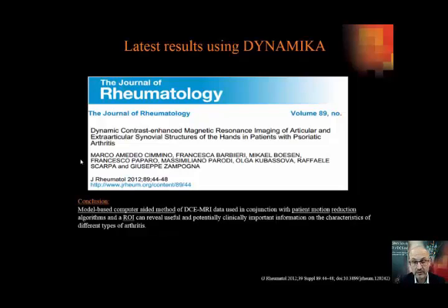This has also been shown to be a potential tool for assessing psoriatic arthritis, even though it's more difficult because the psoriatic arthritis lies in the capsule more than in the synovium, which gives you some obstacles if you have to separate vessels in the subcutaneous area from the corresponding enhancement in the capsule. But it's a useful tool and seems to be important.